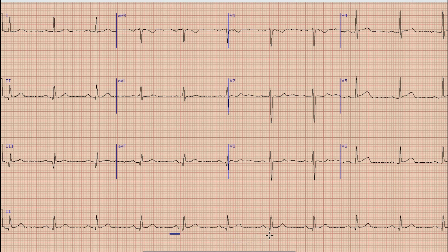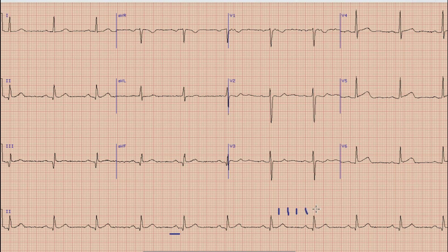The next step in ECG interpretation is heart rate calculation. We select a QRS complex which lies on a broad vertical line and then we calculate the large boxes between that QRS complex and the next QRS complex — at 300, 150, 100, 75, 60, and so on. So as you can see, the heart rate in this case is 60 beats per minute. This is a sinus rhythm at 60 beats per minute.